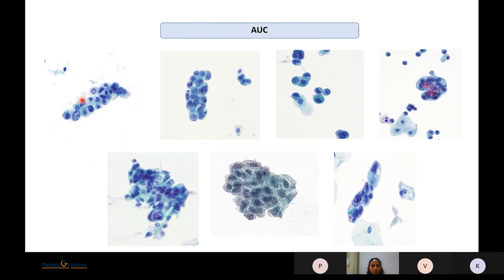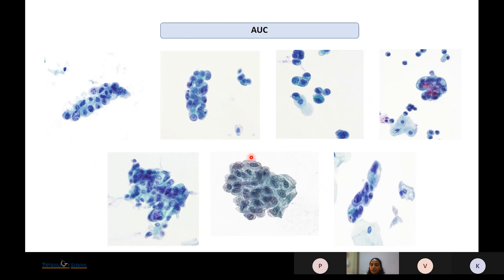Images of atypical urothelial cells show nucleomegaly with irregular nuclear contours but no hyperchromasia or irregular clumped chromatin. In degenerated cells where nuclear chromatin cannot be well visualized, they are placed in the atypical urothelial cell category. Even if not all cells show nucleomegaly, a single cell with nucleomegaly and irregular nuclear contours places the specimen in the Atypical Urothelial Cells category.